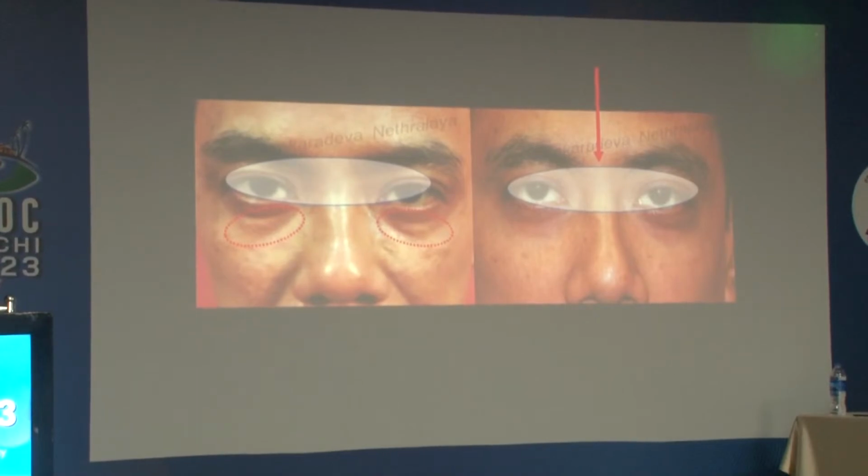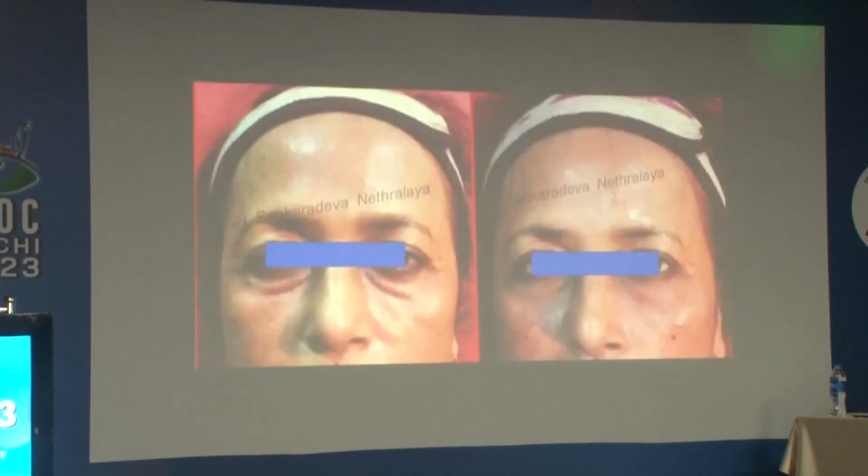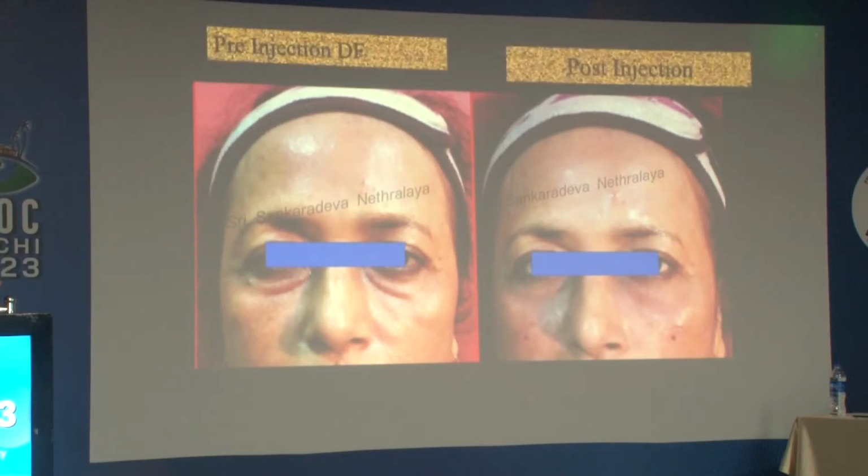I want to mention that results are immediate. If you really look at this, see, this is the injection. This is only a one point entry of the cannula, and look at the change. The bags out here, you almost see that they have gone. So there are different ways and there are different indications.